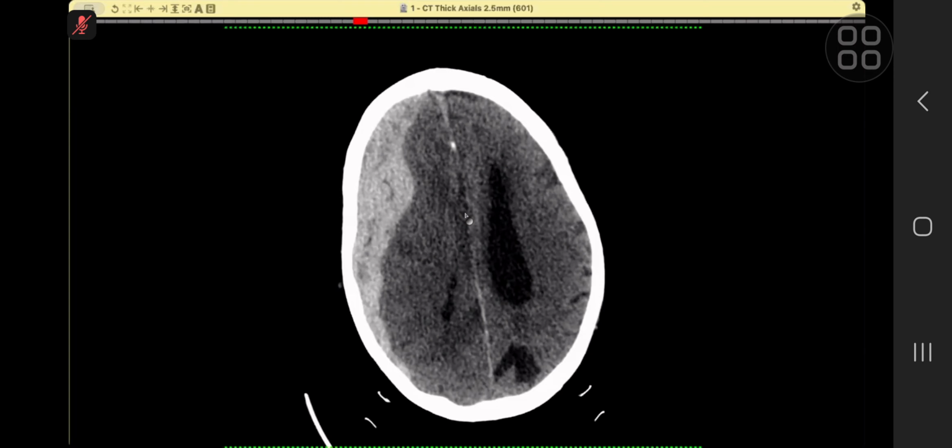Over the last 15, 16 years, I think I have seen five similar cases, and I've been in the coroner's court quite a few times as a witness for these kinds of cases. So I always highlight to my trainees, always look in the subdural hematoma window. One mistake can be a very big mistake. It will be a fatal mistake.